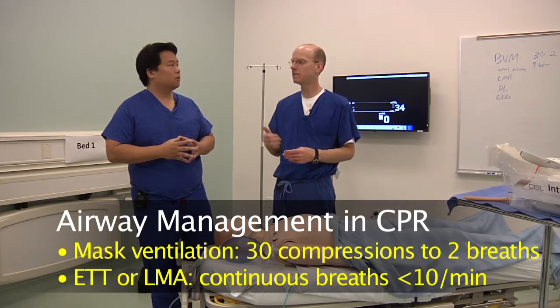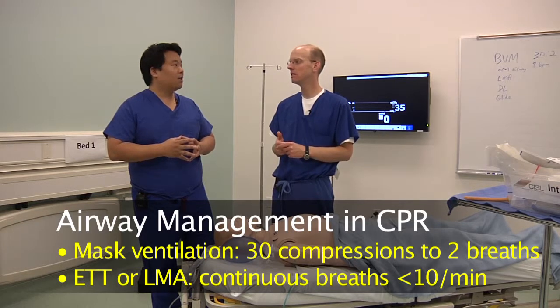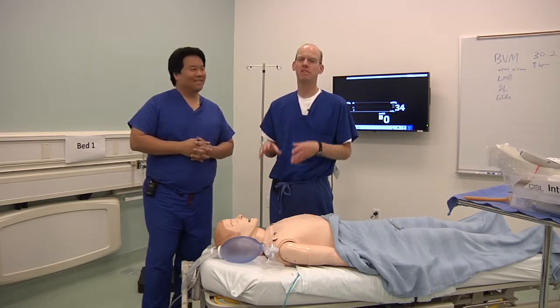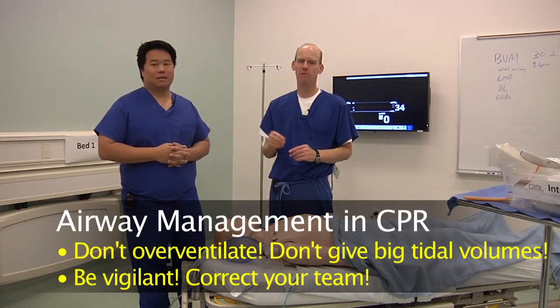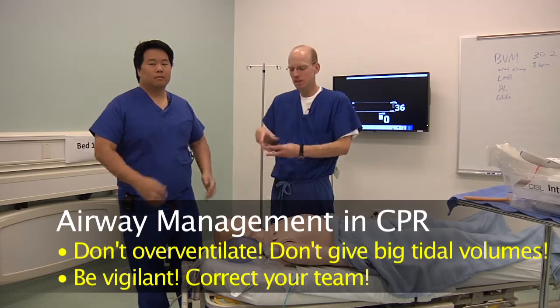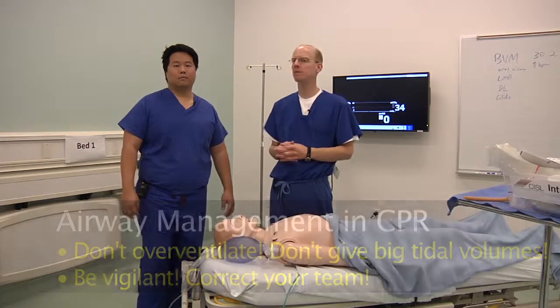Do you know what the average ventilation rate is during an arrest? Higher than that. I assure you. It's about 30. Do you know why it's 30? You can't squeeze an ambu bag any faster. Trust me, this is something that's going to happen. People are going to overventilate. You have to watch for it. You have to correct your team. And you got to make sure they don't get big tidal breaths, because you may get them slowed down, but then they're going to just give these big tidal breaths. It's little puffs just to get some oxygen into the patient.